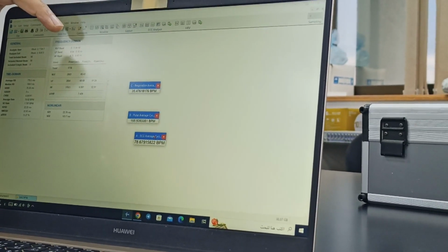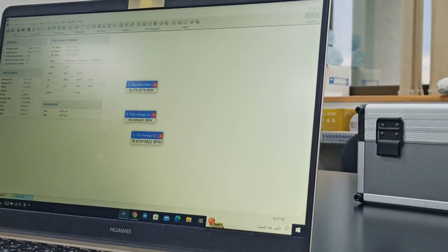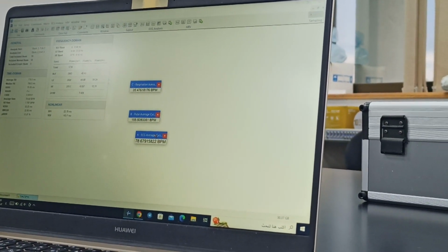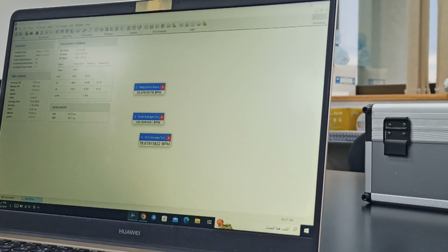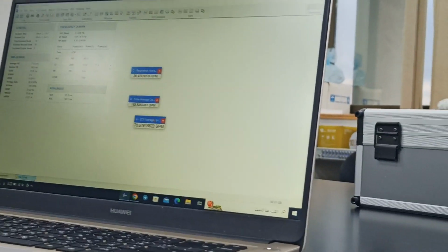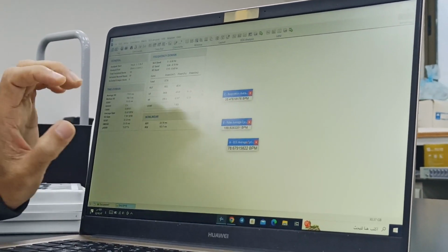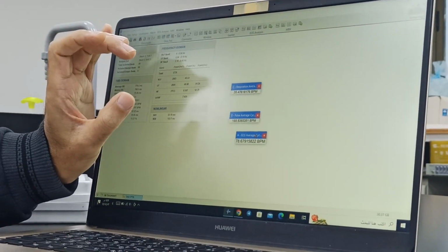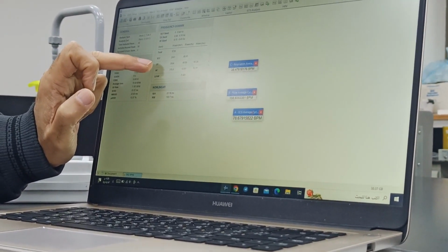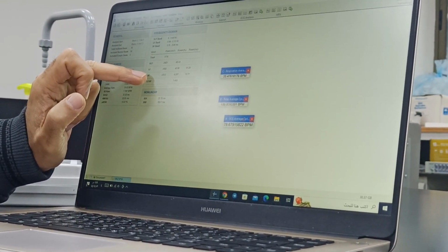There is another type of calculation which is called frequency domain. There is a system that calculates how many peaks there are, which frequency is high, which frequency is low. They say that it is Fourier transformation. So that's mathematical. I am not good in that. But again, it will give us a good idea about the activity of the sympathetic and parasympathetic system. And we are concerned with LF, low frequency, and high frequency, HF.